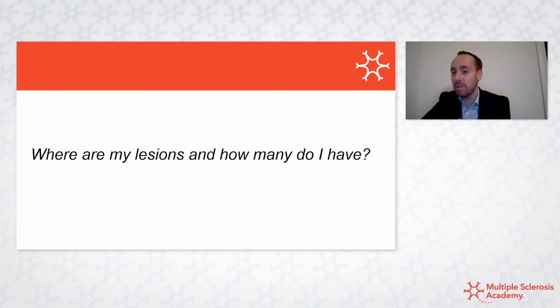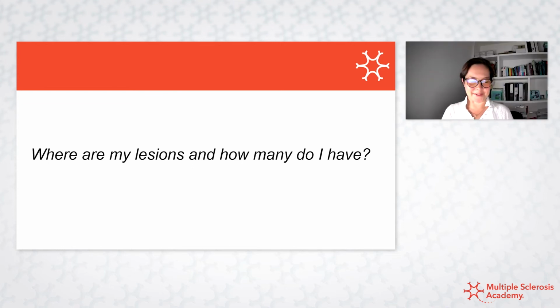I don't count the lesions because I think the actual number doesn't really matter that much. Audrey, you'd be at work for 22 hours a day if you counted every white spot on the MRIs. Would that be right? I've got quite fast at counting them, Wallace. And I don't count them to give an absolute number, because it's utterly meaningless to give. Does it matter if you've got 7 rather than 9, or 24 rather than 32?